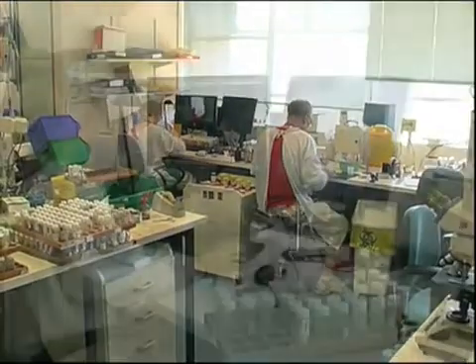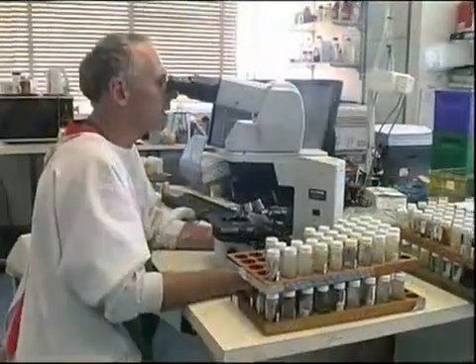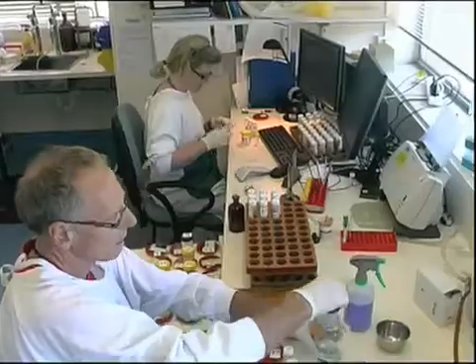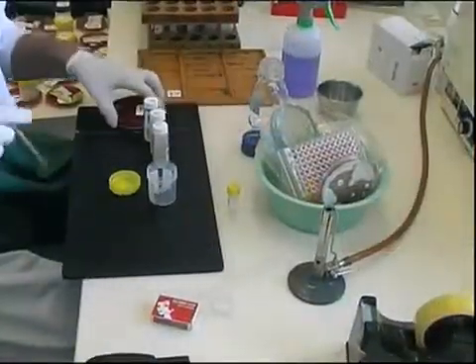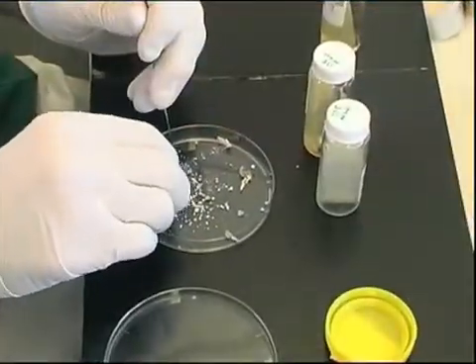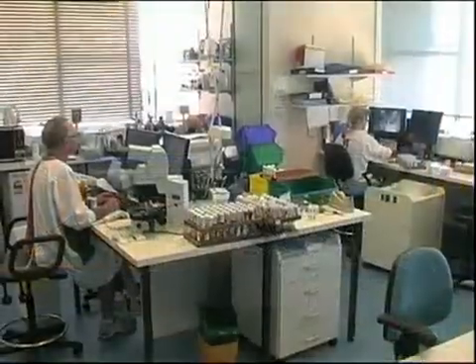Every day the mycology unit receives many specimens for the diagnosis of fungal infections from skin and nails. The ability of the laboratory to detect a fungus is very much dependent on the quality of the specimen it receives. It is necessary to collect an adequate amount of material for both microscopy and culture — quantity is the most important thing. This short video will demonstrate the proper collection techniques necessary to generate a good laboratory specimen for the diagnosis of cutaneous fungal infections and onychomycosis.